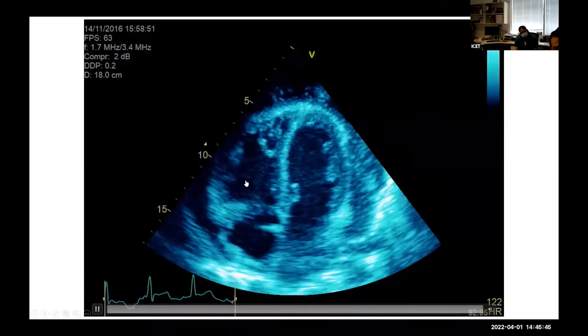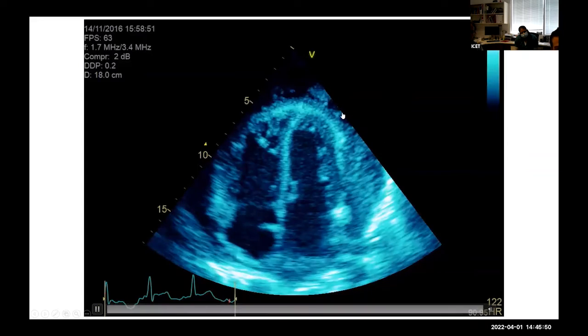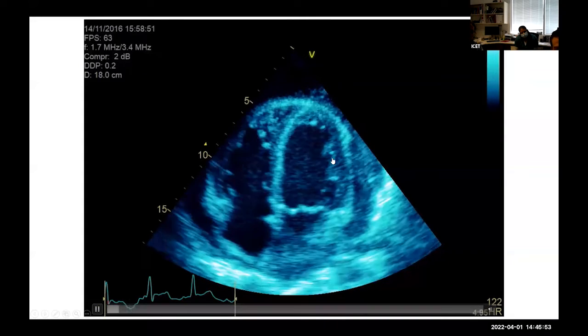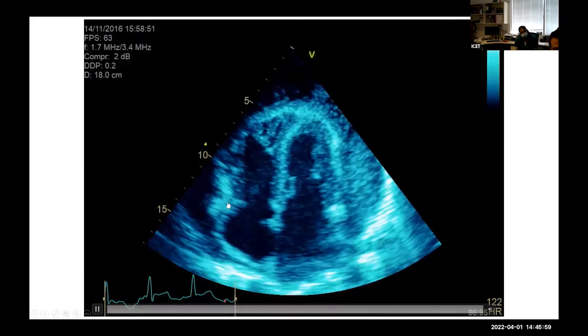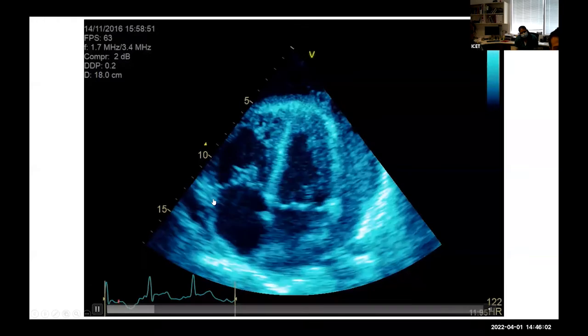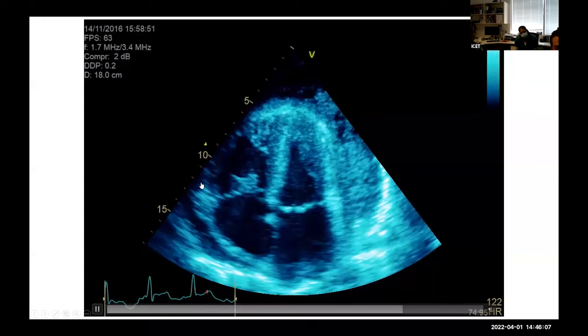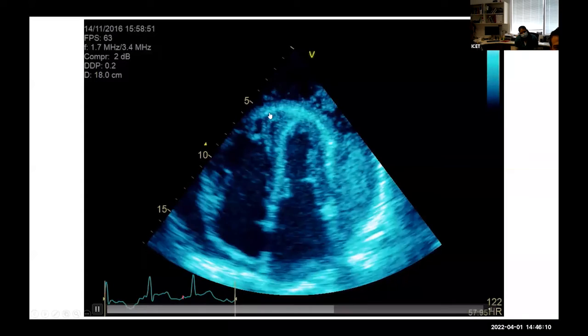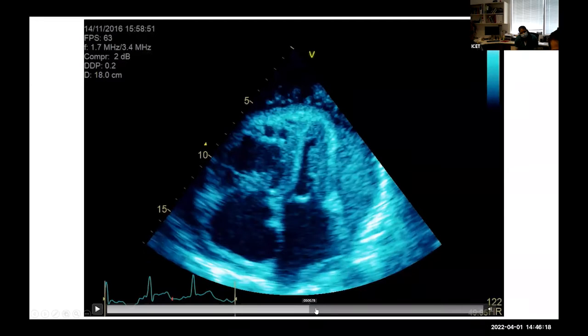With regards to the left ventricle for a second, otherwise contractile function is bordering on hyperdynamic. With regards to the right ventricle, it's significantly dilated, heavily trabeculated, and apex forming. It's got preserved lateral contractility, but its apex is certainly not contracting. There is probably a vegetation associated with the tricuspid valve in this view, but the heart's moving so much at a rate of 120, it's hard to be sure.